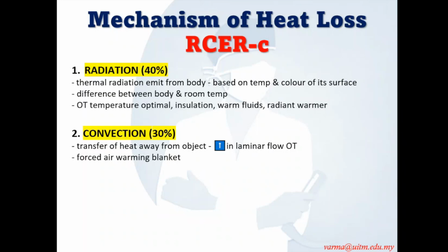That is the reason for using a forced air warming blanket. We want to maintain the immediate temperature around the patient as warm.